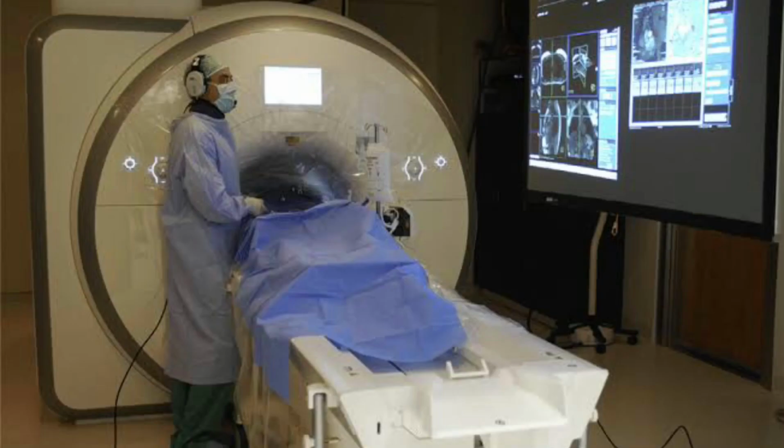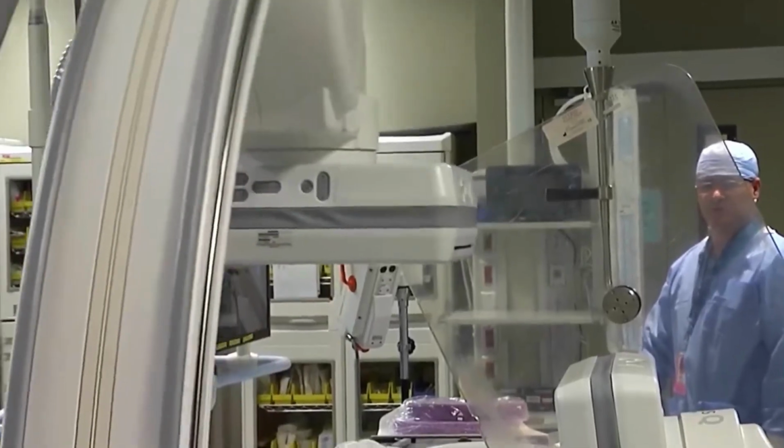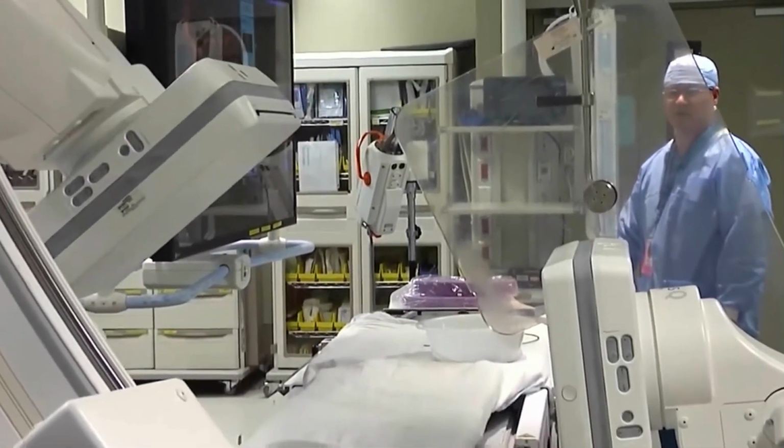Interventional radiology has the basic concept of keyhole surgery with X-ray vision. Although in today's practice, the vision can also be provided by other modalities, for example, ultrasound, MRI, and CT, fluoroscopy is the most used in an interventional procedure.